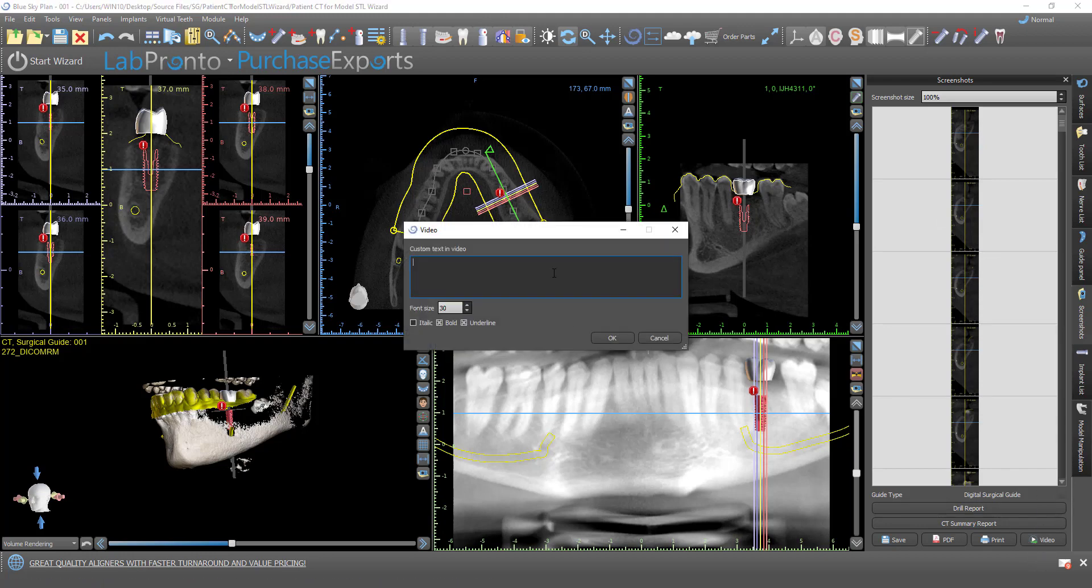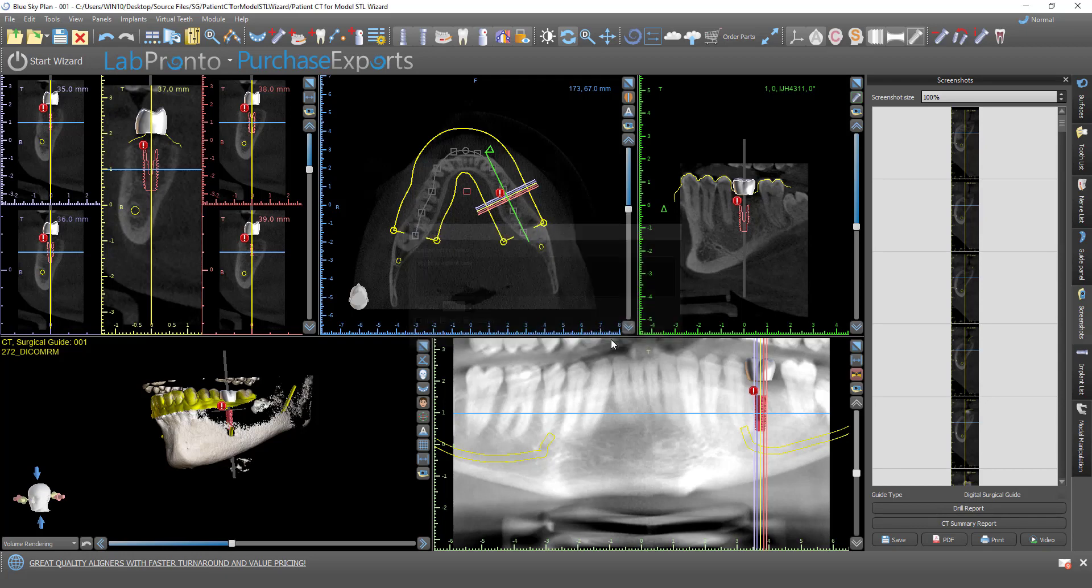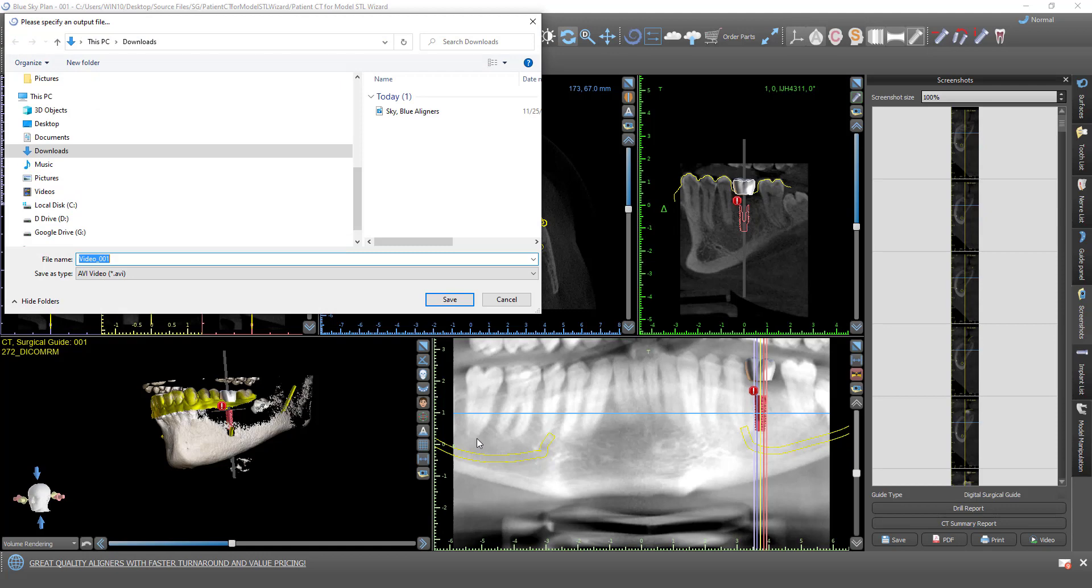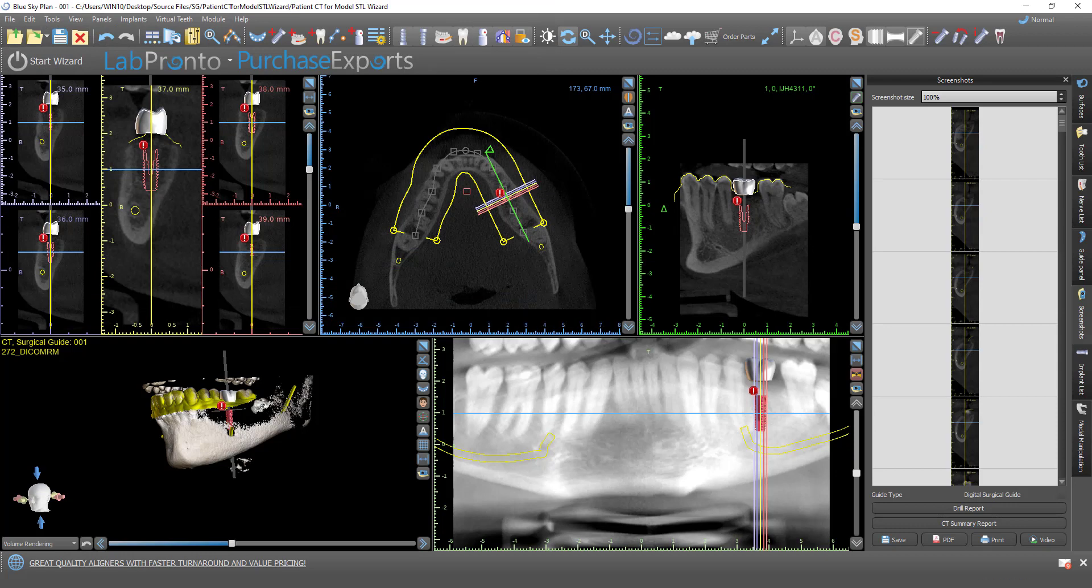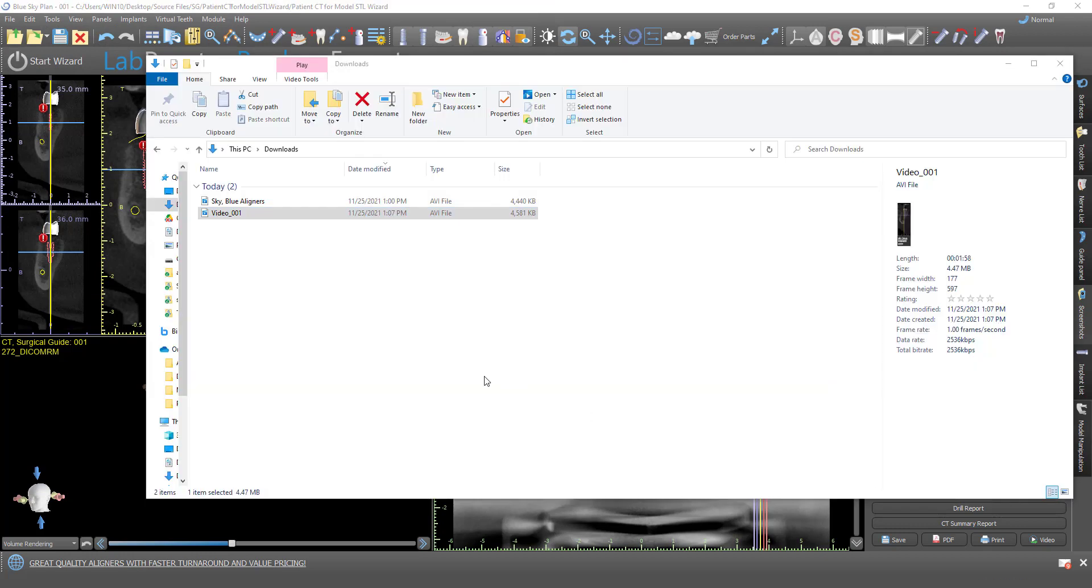You could put in any custom text, sky blue implant case, change the size, some editing options, and click on OK. Just leave this as video 01 for now. Click save.